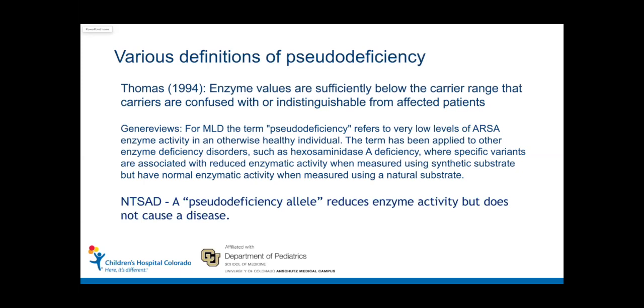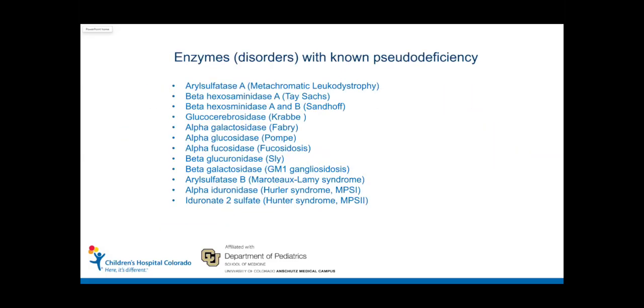Because we're using enzyme activity in newborn screening, we're starting to find out how common pseudodeficiency is. I know I was one of the people that didn't think this would be as big an issue as it is. So I just want to talk a little bit about what pseudodeficiency is. It's not something that's just related to MPS. In fact, it was described first in a couple of other lysosomal conditions. These are a subset of disorders with known pseudodeficiency. And in fact, I think the list grows every year as we find more of these alleles.